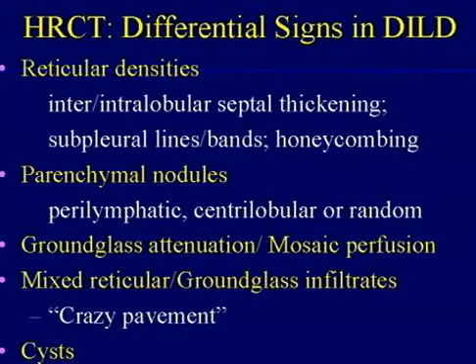And the notion of a standalone high-resolution CT study, which is 1 millimeter thick sections every 10 millimeters in most places, in a sense is an anachronism. The exception to that would be if you have someone you're repeatedly scanning over time and there's a question of radiation dose, and you really know what you're dealing with, you have an established diagnosis, and you're just looking for a response, and you're not worried about the development of a lung cancer, so now you're talking about a fairly small group.